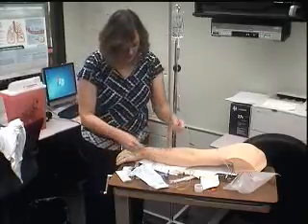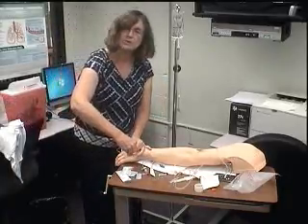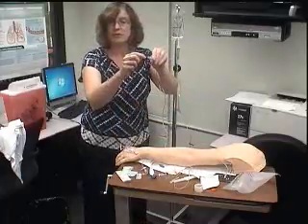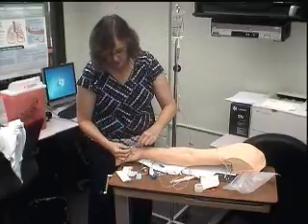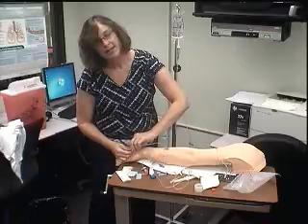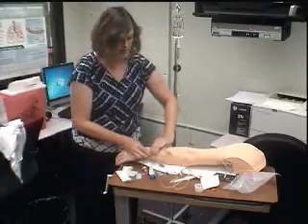So I've scrubbed my hub on my saline lock. Scrub, scrub, scrub. Then I can take, again, be careful not to contaminate. Take this off. Do not touch here. If you do, it's contaminated. After I've scrubbed, I hook it up, push it, twist it, righty-tighty, lefty-loosey. So tighten it up. There's a little knob that tightens. And then I could put a piece of tape on here.